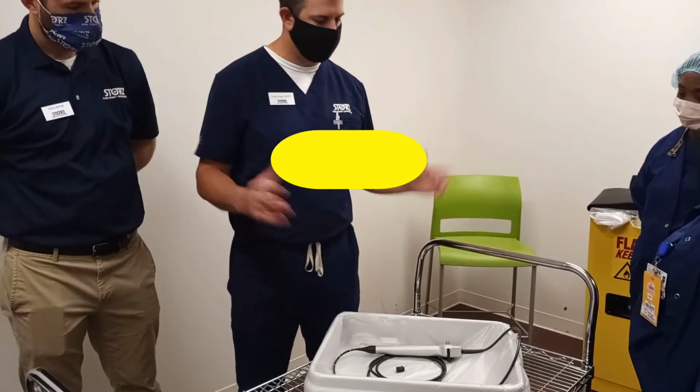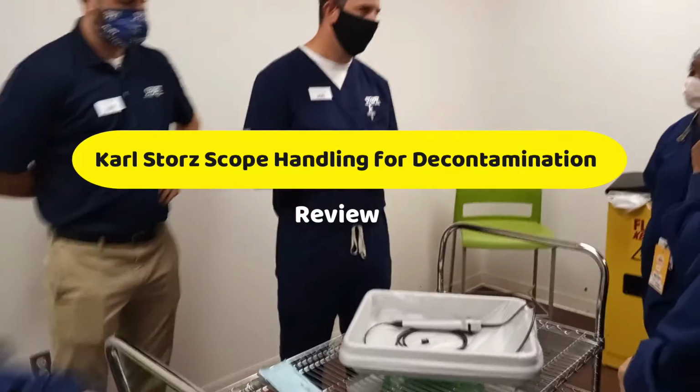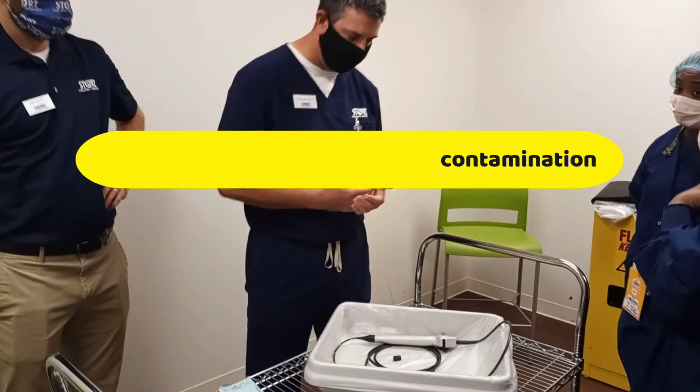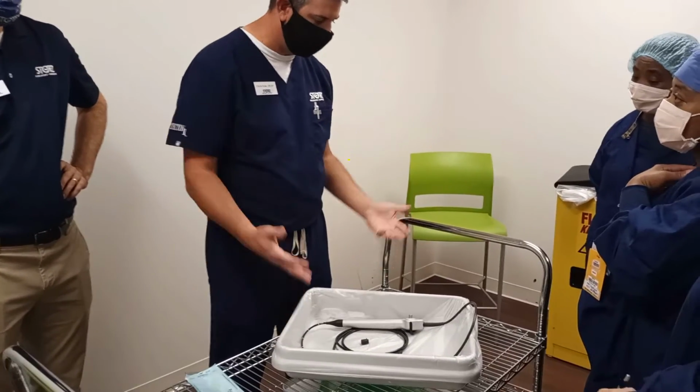Like Eric said, my name's Chuck. I'm the field service technician for the area. But yeah, just kind of go over the care and handling of the flexible scope. As Eric mentioned, it comes down in the basket.